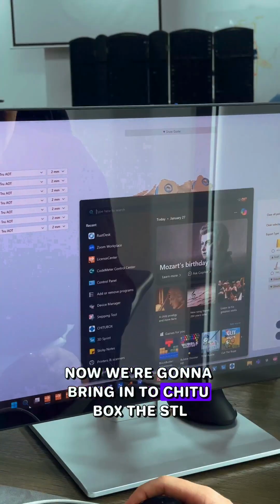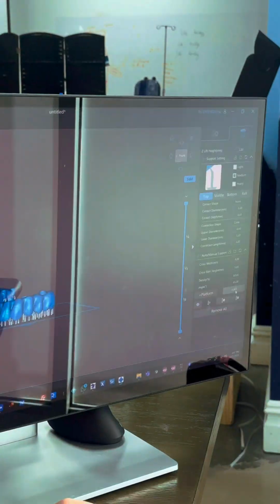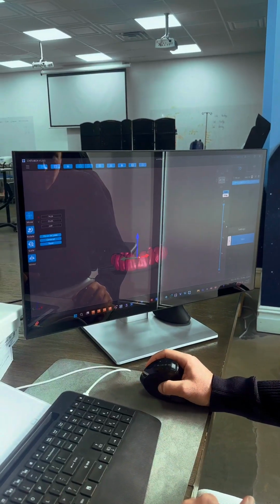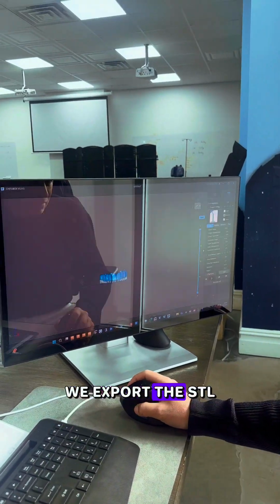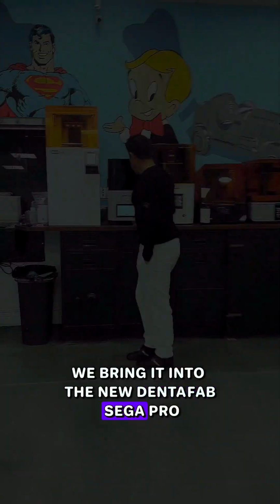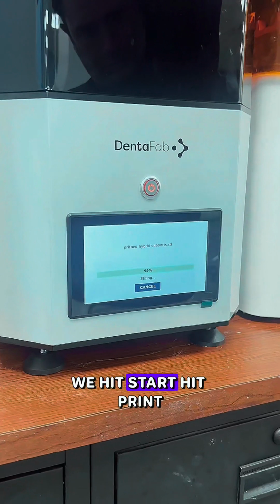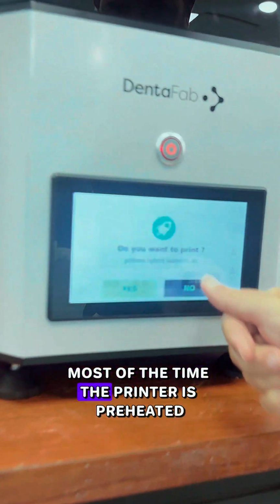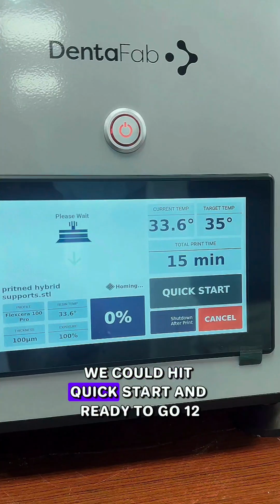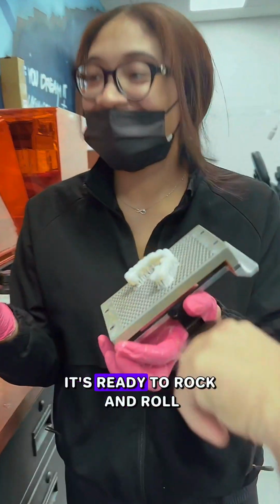Now we're going to bring the STL into Chitubox, flip it over with a 2 millimeter Z height. We export the STL. We bring it into the new Sega Pro, and we are going to print this. It sends it over and it slices it. We hit start, hit print. Most of the time the printer is preheated. We could hit quick start and ready to go. 12-15 minutes later, it comes out, it's ready to rock and roll.